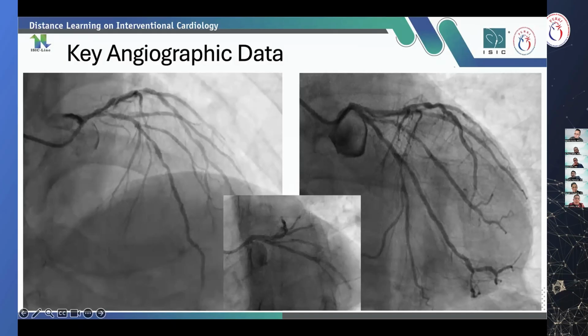Yes, well, first we assess the coronary is very complex, and there are many significant side branches. First, we're thinking that maybe there is a bifurcation problem in the left main, because the non-invasive treadmill test shows that there is aVR ST elevation and precordial ST depression until the lateral.